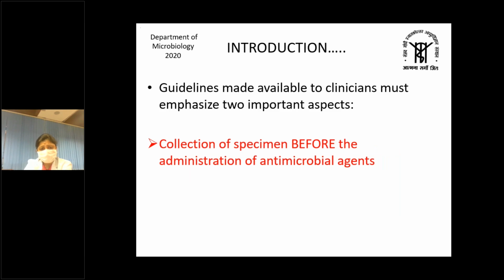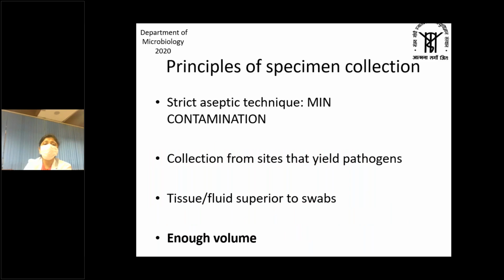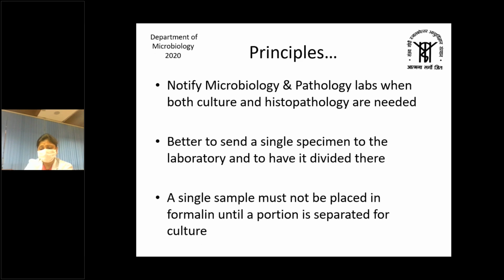Then, as I emphasized, samples should be collected before the administration of antimicrobial agents and with strict aseptic precautions, which prevent the contamination of the specimen with normal flora of the body. Tissue and fluids are always superior to swabs, and the maximum volume should be collected.